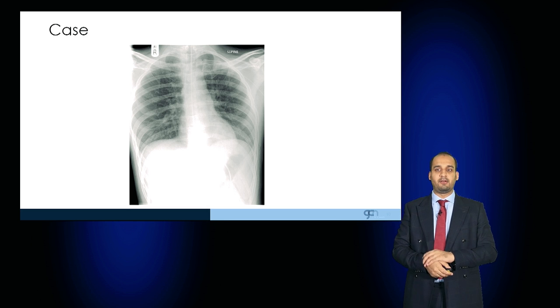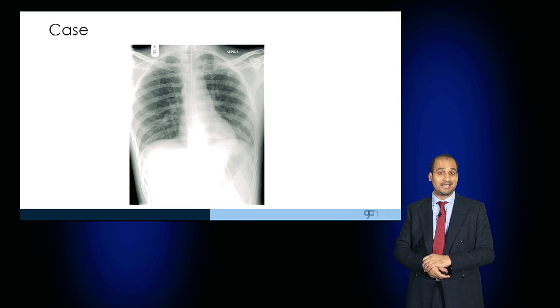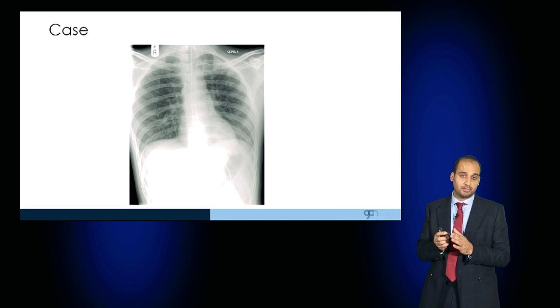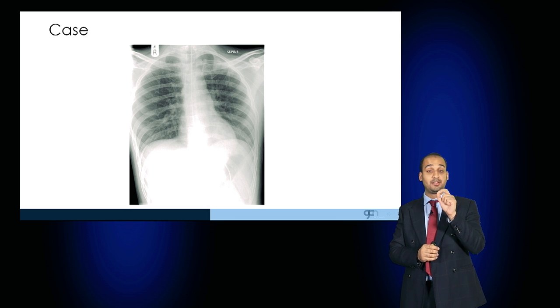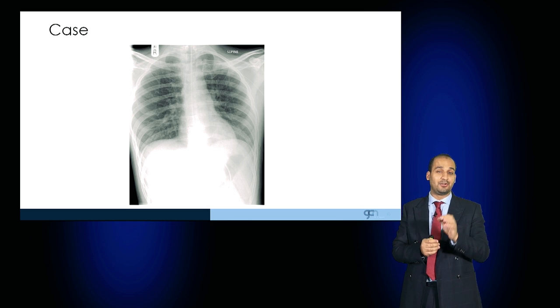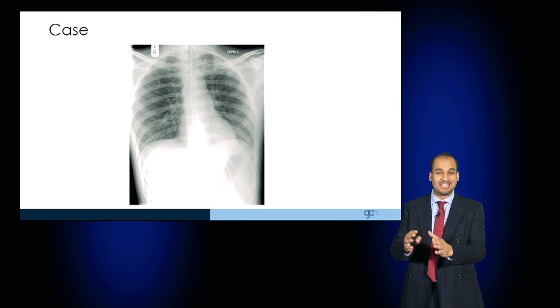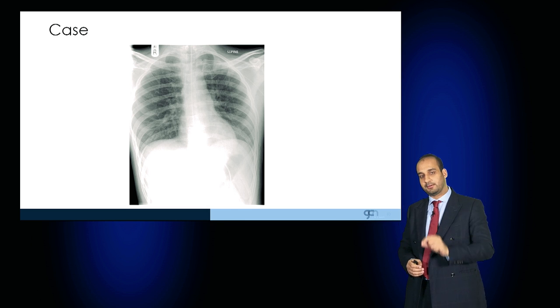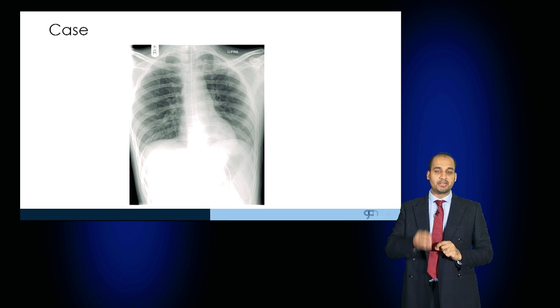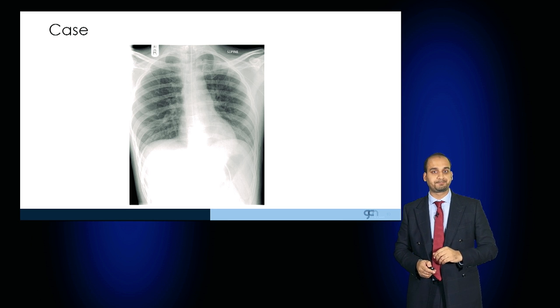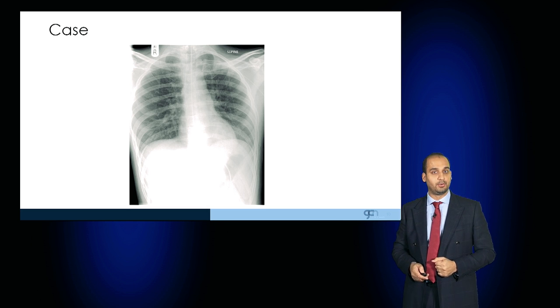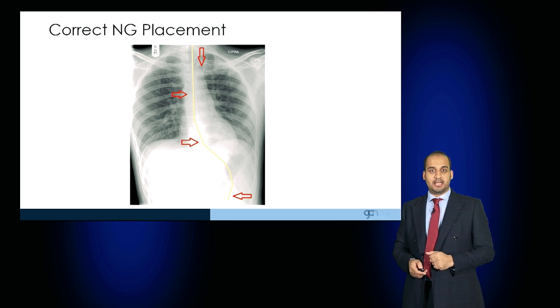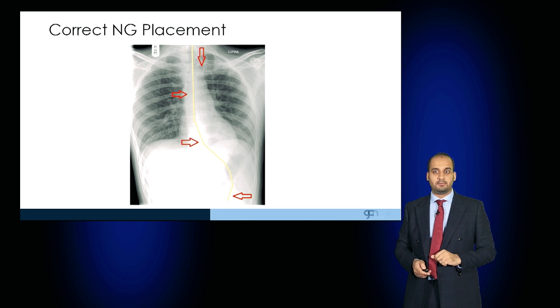This is very important — we're looking at the foreign body here, which is the nasogastric tube. It's a mandatory requirement to ensure that these images have senior review, because if an NG tube is sited in the wrong place and ends up in the lungs, it can cause a serious pneumonia resulting in morbidity and mortality. The NG tube should bisect the carina, bisect the diaphragm, and end up in the stomach. You can aspirate the content to determine the pH, but a chest radiograph is very important. And you can trace the entire NG tube there.